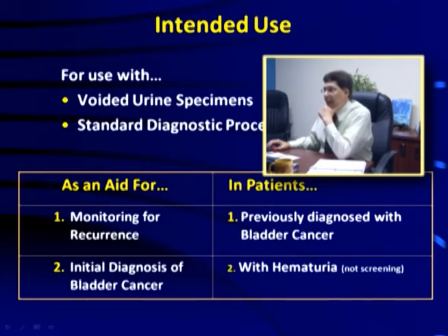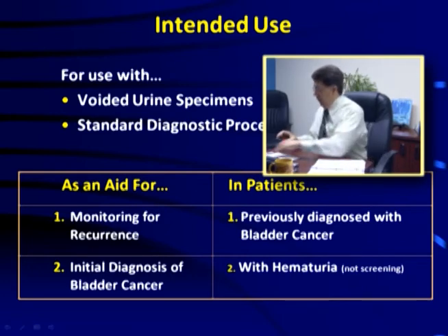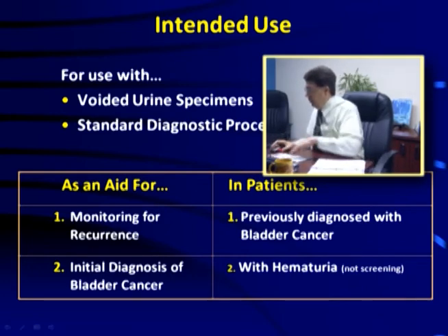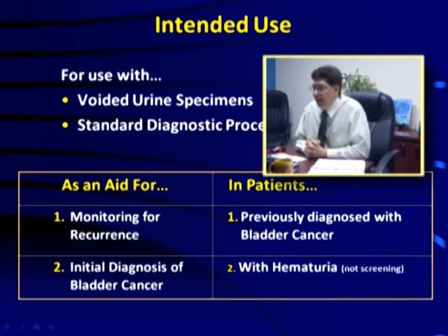The problem is, if it's abnormal and there's only hematuria, then more likely than not, the clinician is not going to see morphologic change with cystoscopy, and they're going to be in a dilemma. And that dilemma has really been responsible for some of the lack of adoption of this technique, because this is one of the few genetic tests where we see genetic change before morphologic change. It does happen on occasion with the heme fish, but rarely, very rarely.